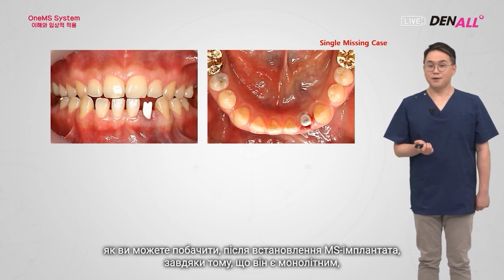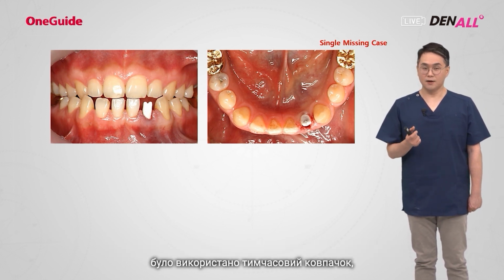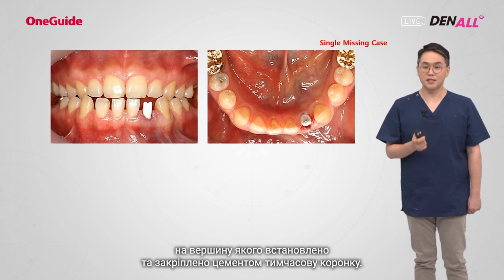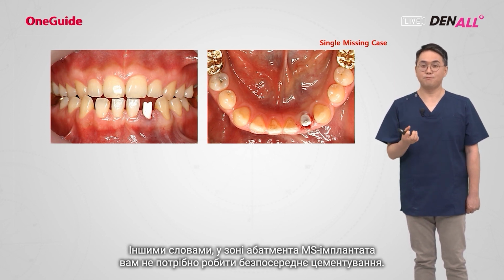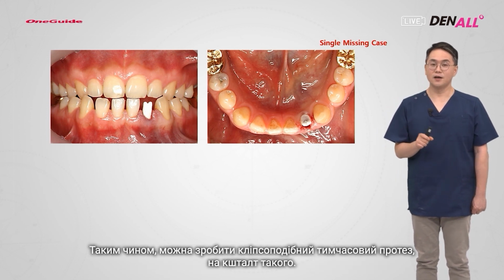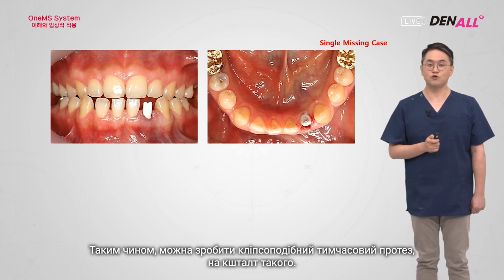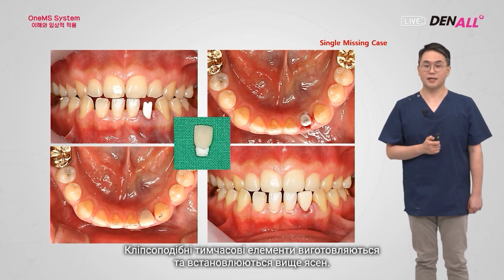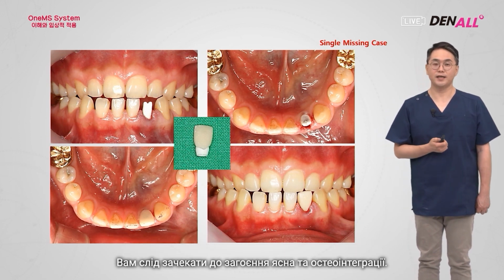As you can see, after placing the MS implant, this is a one-body implant, so a provisional cap is used. The temporary crown is cemented onto the provisional cap. In other words, you don't cement directly to the abutment area of the MS implant. So, like a clip-on type prosthesis, a temporary prosthesis can be made. Like this, clip-on type provisionals are made and delivered. After that, you wait for gingival healing and osseointegration.